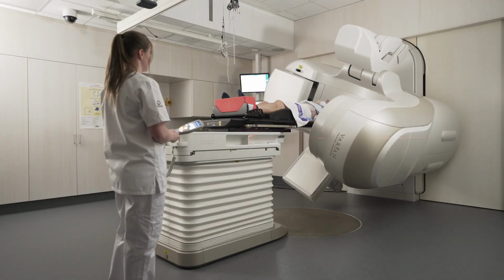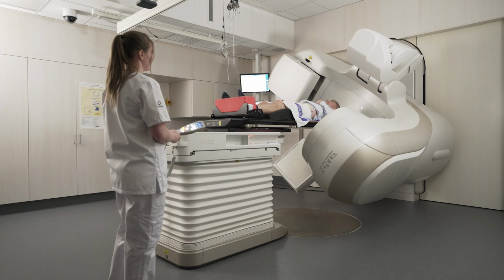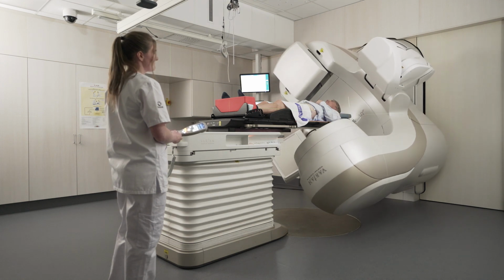The concept of MRI-only radiotherapy planning opens up a lot of new treatment options for us. Since the MRI does not provide any radiation to the patient, additional replanning between the treatment fractions is clinically feasible. The majority of tumours change their volumes during the treatment. They increase and they decrease.